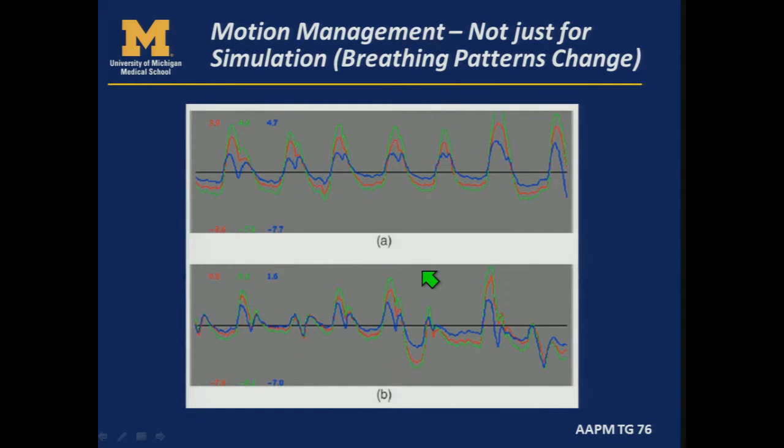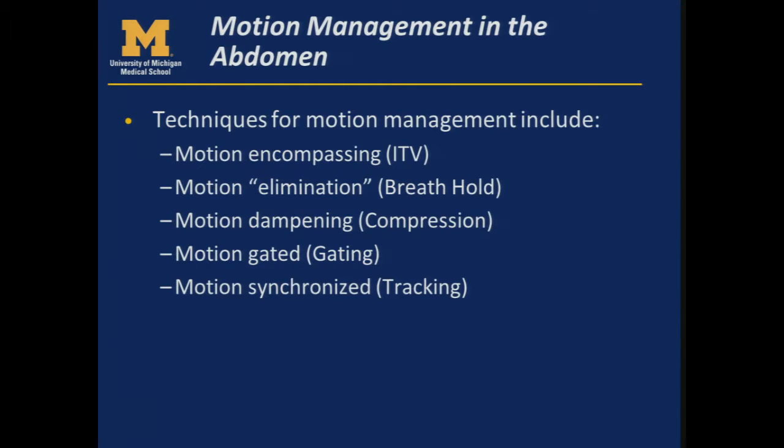And we know that it's not just something to look at in simulation. We see that patients' breathing patterns change throughout treatment and even throughout the same treatment session. And so the different techniques that we can use to manage and assess motion in the abdomen are very similar to what you would see for other sites where we worry about respiration. So motion encompassing methods, so the ITV approach, motion elimination methods, which I put in quotes here because it's very difficult to completely eliminate motion. So breath hold techniques, motion dampening such as compression, and motion gating, and then motion synchronized treatment such as tracking.